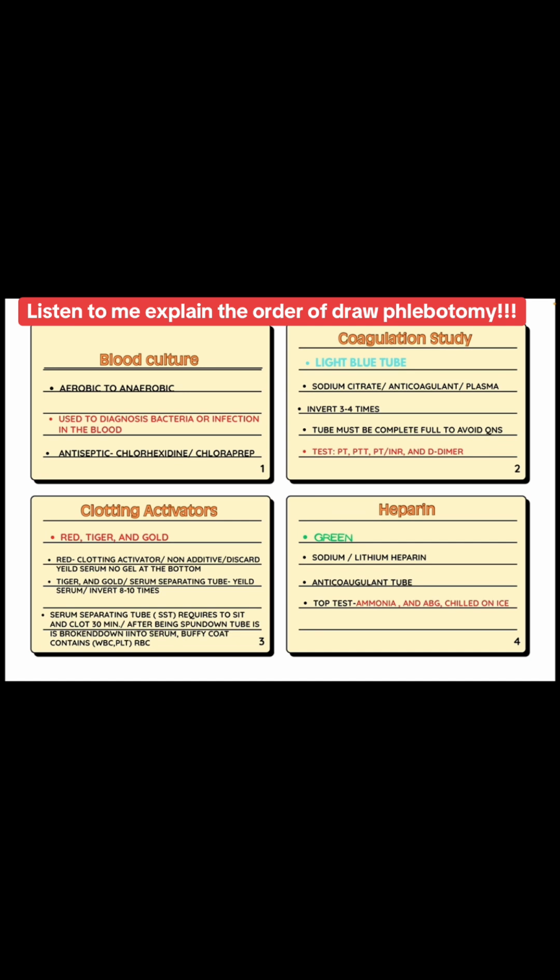When your doctor orders a blood culture, it's to check if there is any bacteria or infection in the blood. We will come across terms like sepsis, and that's poisoning in the blood. The different type of antiseptic that you can use is ChloraPrep chlorhexidine. You will use a butterfly to collect the sample. You can use the syringe method, or you can just apply the bottles to the end of the butterfly needle. They come with their own hub.